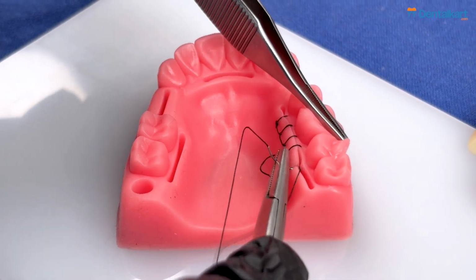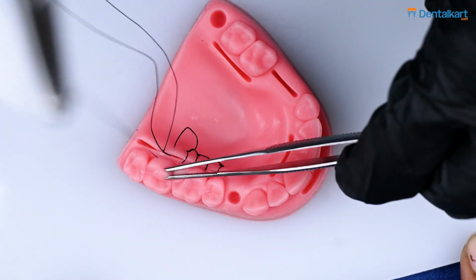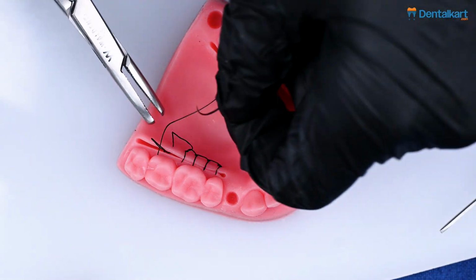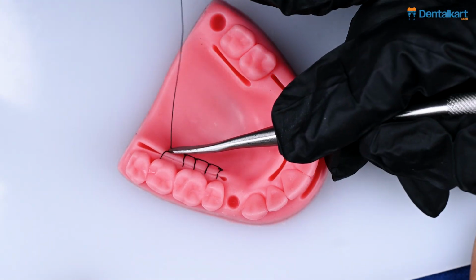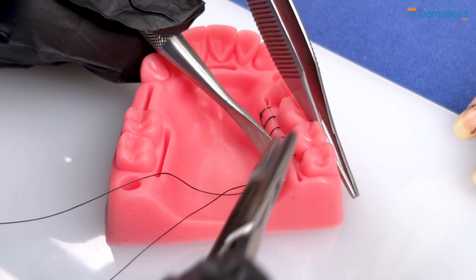And in comparison to a simple interrupted suture or individual sutures, you are still saving a lot of time. The key here is the locking mechanism. That is the main difference between this and the simple continuous suture. And adaptation of each knot before going on to the next knot is important. You can take help of your assistant to do that.